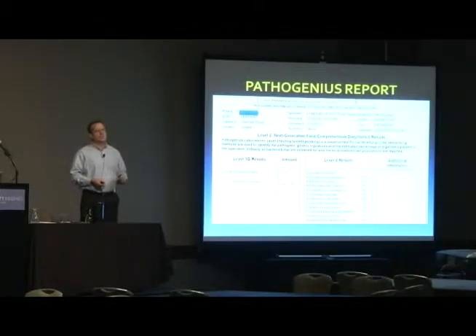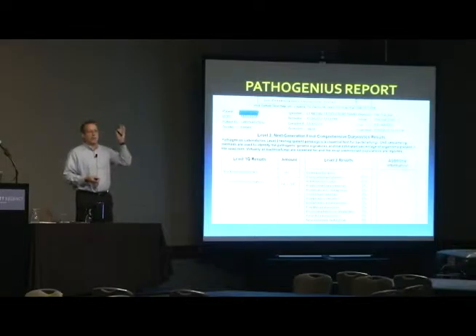If we tell you there's a high bacterial load, that's kind of your first flag that you have a problem. All wounds will have bacteria, but the higher the load, the greater the barrier to healing. If this report came back at 10 to the third and you took the dressing off and you looked at the wound and the margins were coming in, there was no drainage, then you say, guess what's happening? The host is winning. And whatever you're doing is helping the patient and the host factors overcome it.